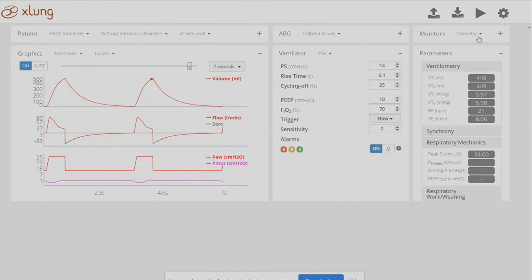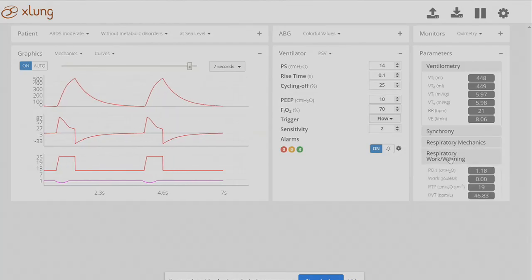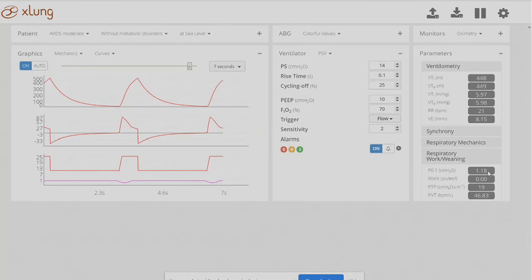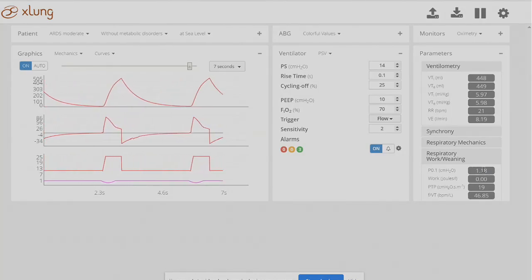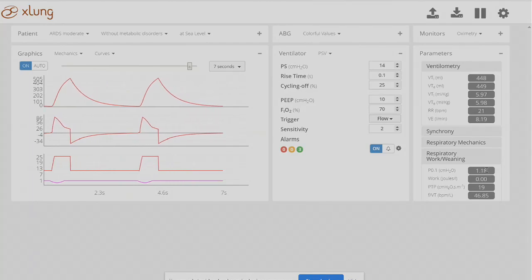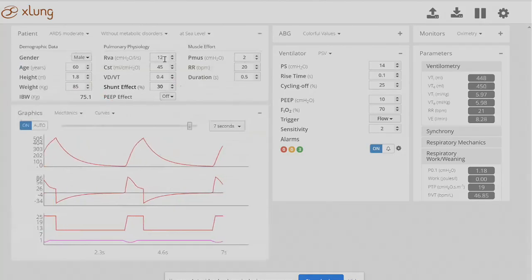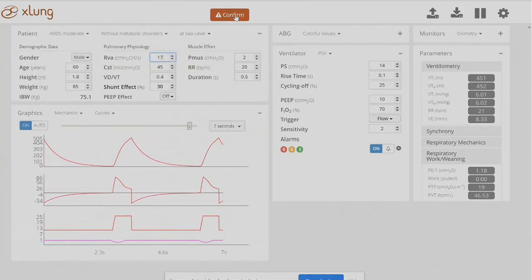And one way we can see if they're being over-assisted is there's a parameter on a vent, P0.1, and you can see it's 1.18, which is not low for a normal patient, but on an intubated patient, this or lower will indicate the patient does not have much drive. Now, this is one problem, but now add this low drive with someone with high resistance and watch what happens.